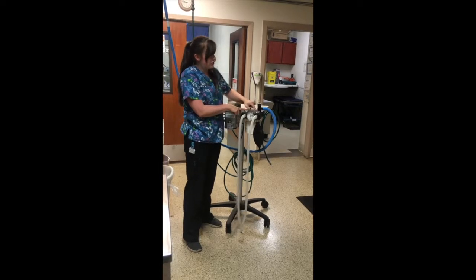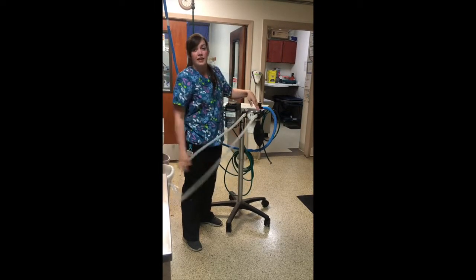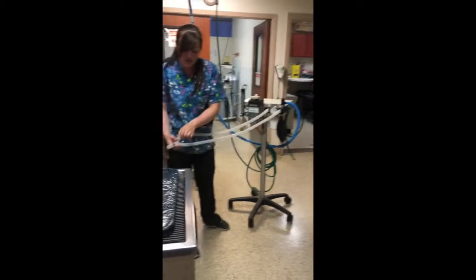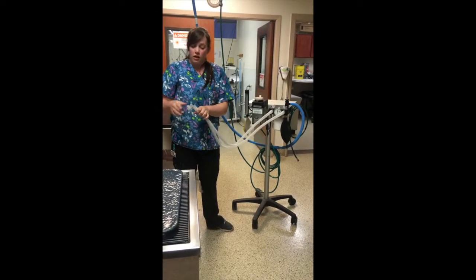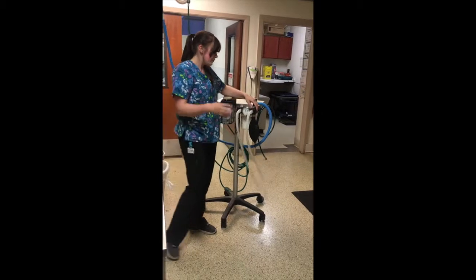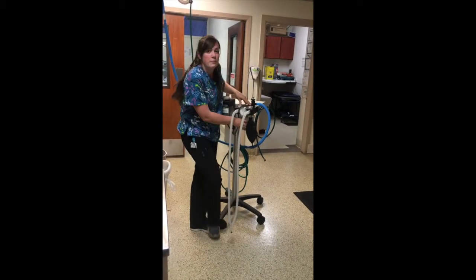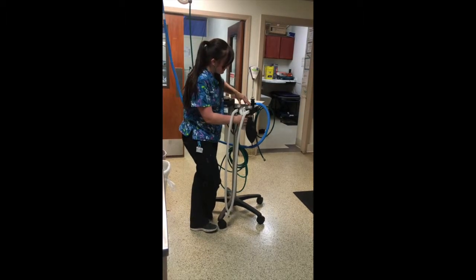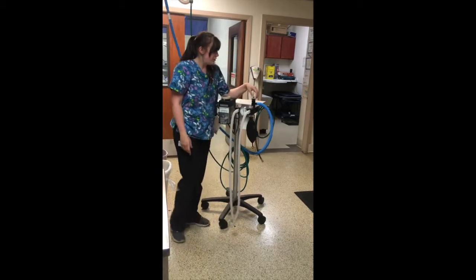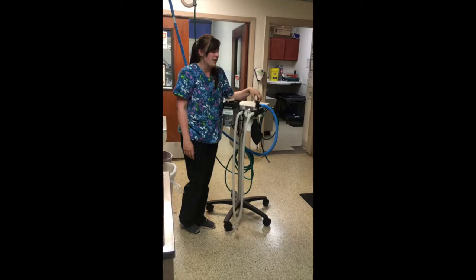So once you've got that, the mixture of anesthetic gases comes through the line through here to our inhalation. There are two flutter valves on top that alternate the pressure depending on whether the patient's inhaling or exhaling. So when the patient inhales, that mixture of gases comes up into the patient here. Once the patient exhales, the exhaled gases come through here into our CO2 soda lime absorbent, and then out through our scavenging system. When we're using this system, we want to keep our pop-off valve open. If this is closed, a patient cannot exhale.